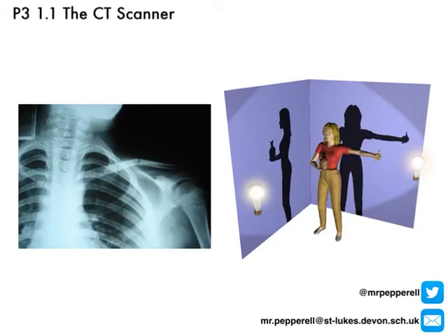Now, X-rays are good for finding stuff like broken collarbones that we've got there, but one big drawback of X-rays is that you're only getting a 2D image, and dense material, like this breastbone here, could be obscuring something a medical practitioner needs to know about, okay?